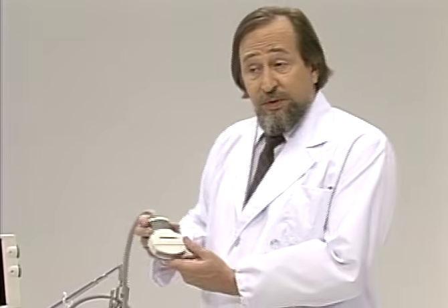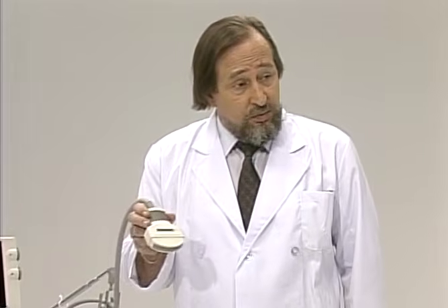During the examination, we use this probe to view the internal structures of the human body. The ultrasound image is displayed as brightness variations ranging from white to black. Internal tissues have inherent acoustic characteristics. The ultrasound beam is reflected at the interface between tissues of different acoustic characteristics. The greater the difference, the stronger the echo. This is displayed with brightness variations ranging from white to black.